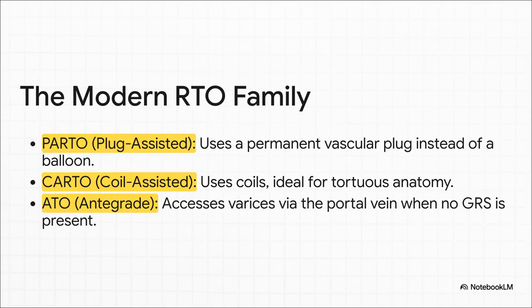Now, BRTO was the classic, but things have evolved into a whole family of modern techniques. PARTO is a huge step forward. Instead of a temporary balloon, we deploy a permanent vascular plug. This is way faster, and you avoid a long ICU stay with a balloon inflated. Then you've got CARTO, which uses coils and a gel foam slurry to do the same thing. It's great for really tricky anatomy.